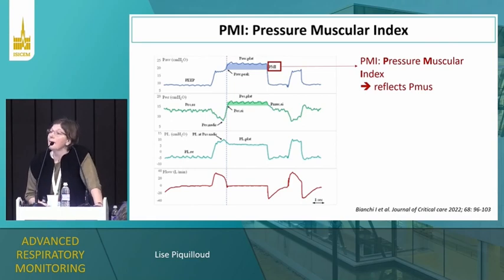Yes? May I ask something? In this setting where the patient is actively breathing, if we do not have an esophageal balloon in place, so to monitor the esophageal pressure, are we absolutely safe to say that during the inspiratory occlusion test, this measurement of pressure is a plateau pressure, not an expiratory pressure during active expiration?